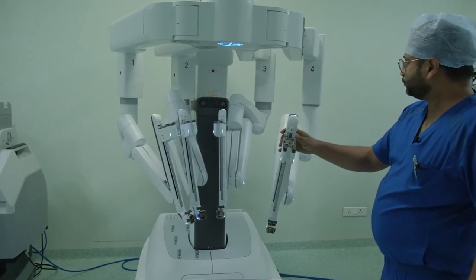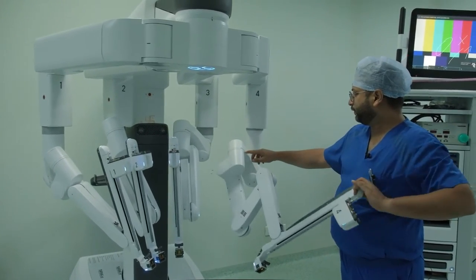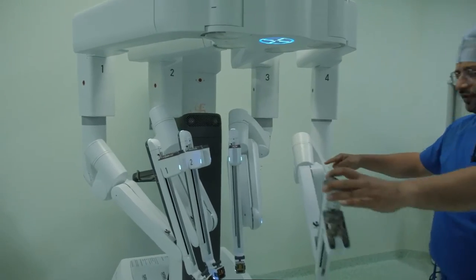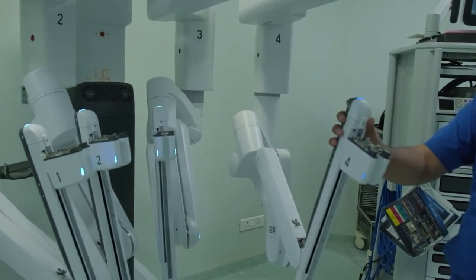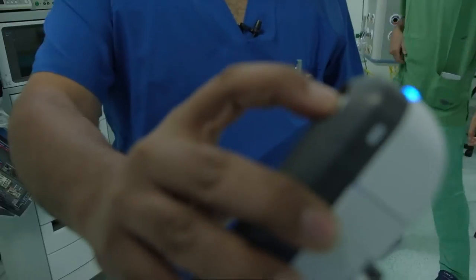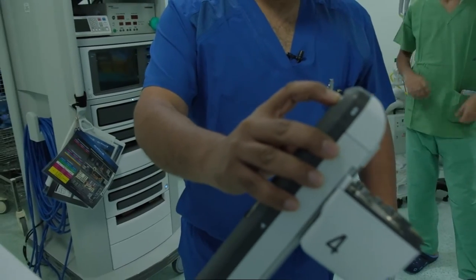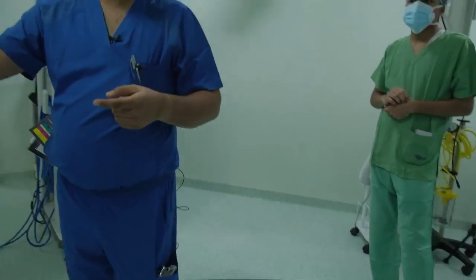There are two portions of the arm. One portion is here, you can see this set of joints. Beyond this, it is controlled by this button at the back, which is the port clutch button. Once you press this button, clutch.